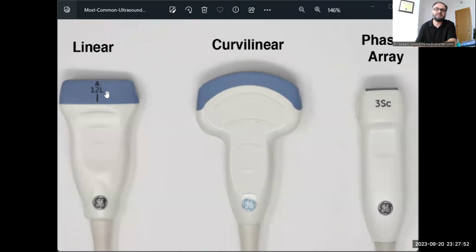So use the probe which has the highest operating frequency, because it produces a shorter SPL. Others have a little longer SPL, and some have a very long SPL. So it is all a matter of the SPL also.